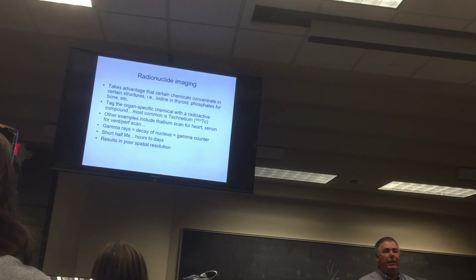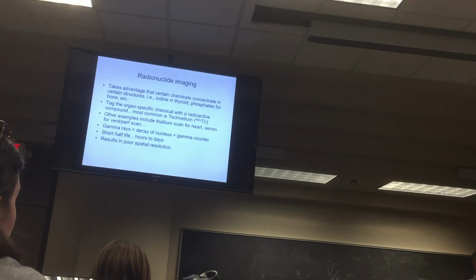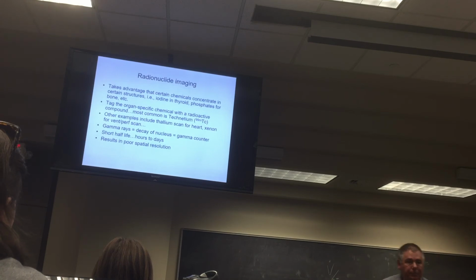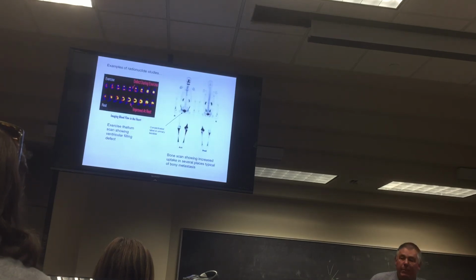Another study though, let me tell you about, is if somebody's bleeding, if you're losing blood chronically and nobody knows where it's going or where it's leaking out, they will draw your blood and tag the red cells and inject them back into you, and wherever it's coming out will show up on a scan. Okay? So here's the type of image you're going to get.